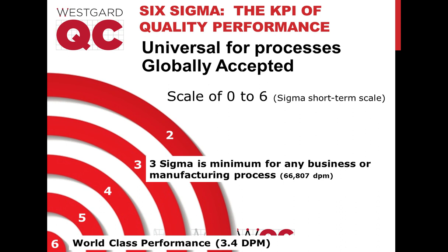I feel like, again, the manufacturer's control may be over-optimized, so that imprecision will come in being a little too low. The imprecision coming from the third party or the independent control is considered best practice as a way to determine your real imprecision.